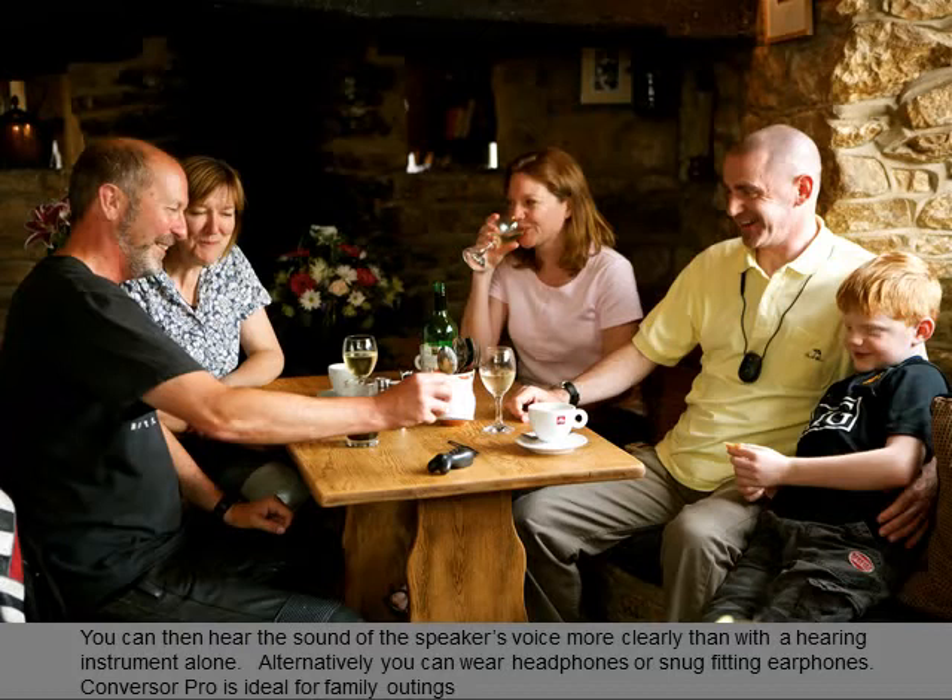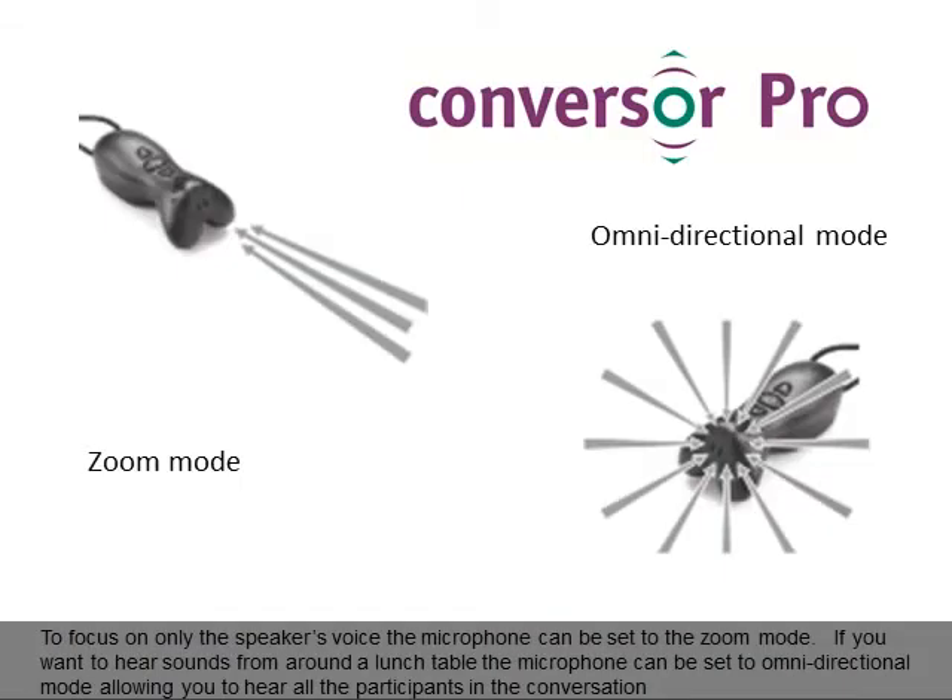Conversa Pro is ideal for family outings. To focus on only the speaker's voice, the microphone can be set to zoom mode. If you want to hear sounds from around a lunch table, the microphone can be set to omnidirectional mode, allowing you to hear all the participants in the conversation.